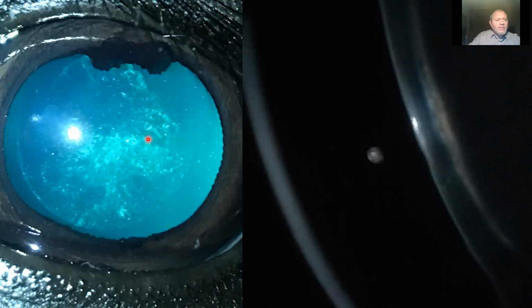There's another cataract here, which is distant direct ophthalmoscopy. We can see opacities within the pupil itself. With a single image, it's quite difficult to know where they are. This is a slit lamp image of the same eye. The left-hand line is the cornea. Then we have the anterior lens capsule, and then the anterior cortex. So these opacities are these sort of shell-like opacities in one single layer, so lamellar cataract.